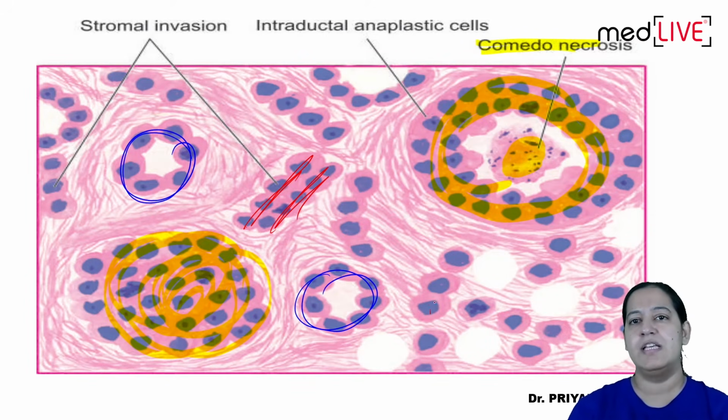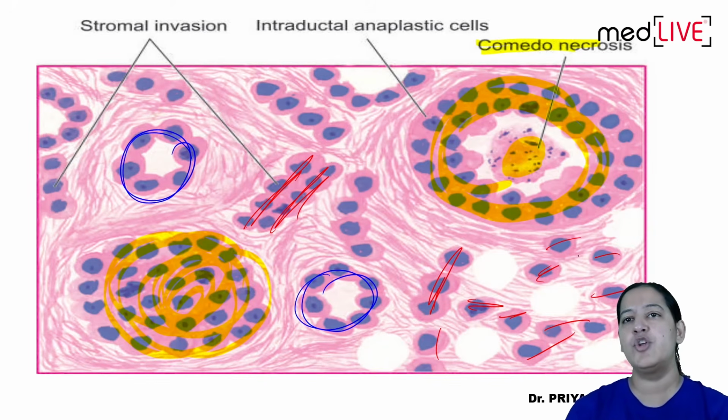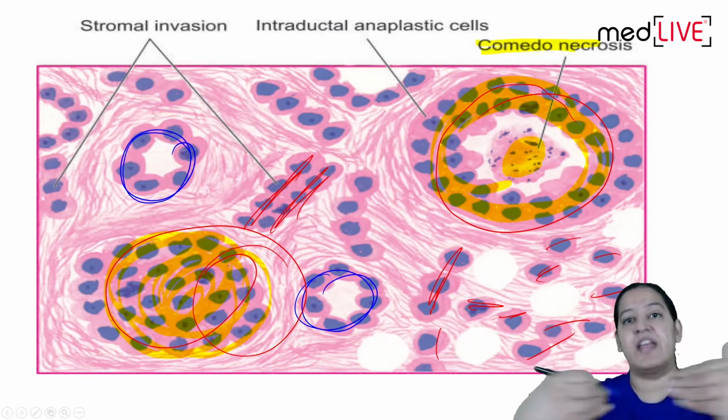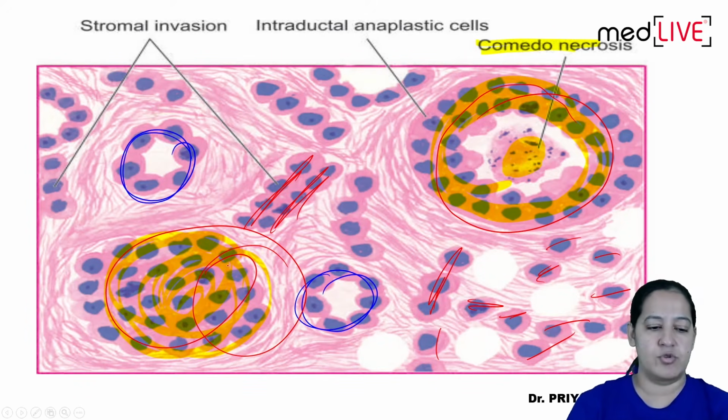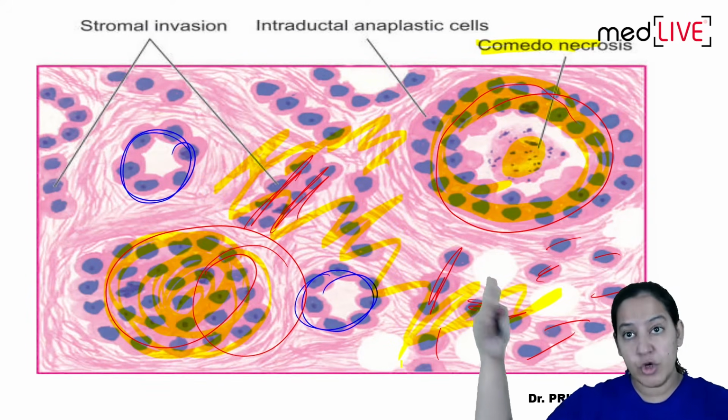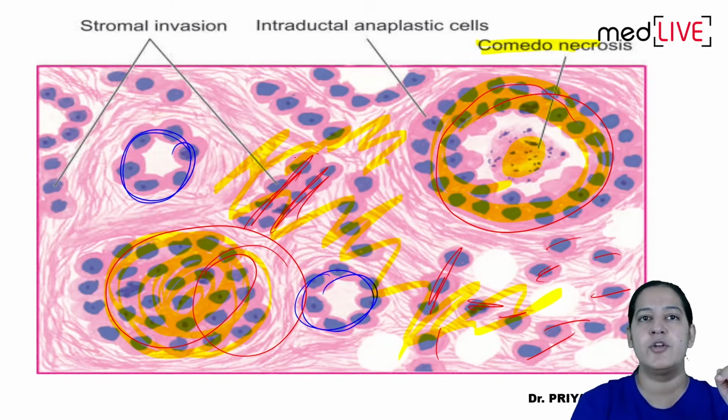These cells, individual cells, these ones. So you will say tumor cells from DCIS, comedo, solid, whatever DCIS is there. Tumor cells are infiltrating and coming in the stroma. See the background stroma. Again, I will show you. Try to see the background stroma. So this is all background stroma. So tumor cells, I have marked the tumor cells here.